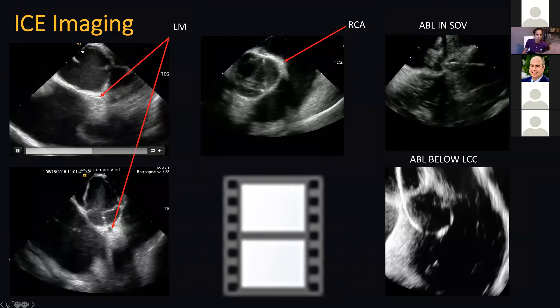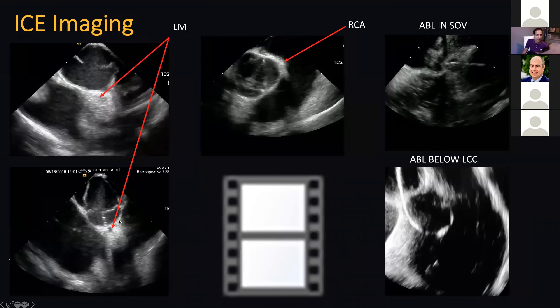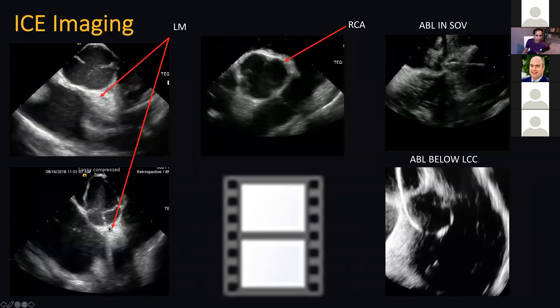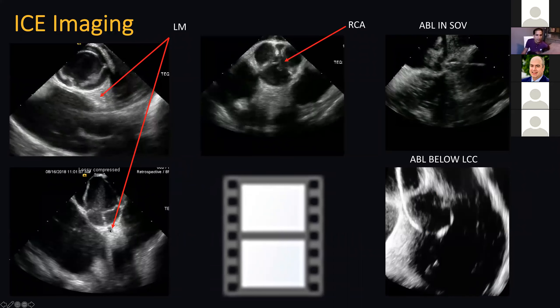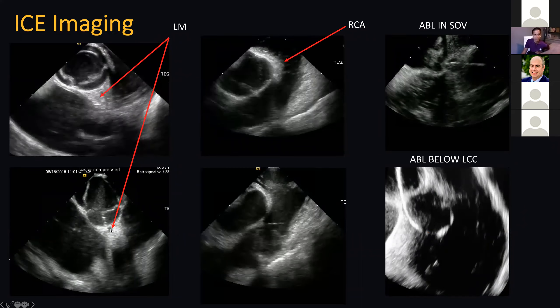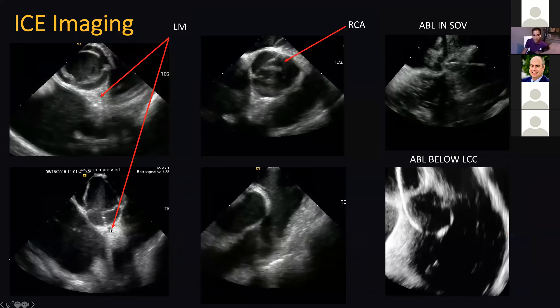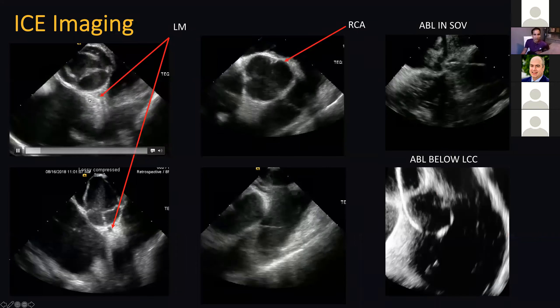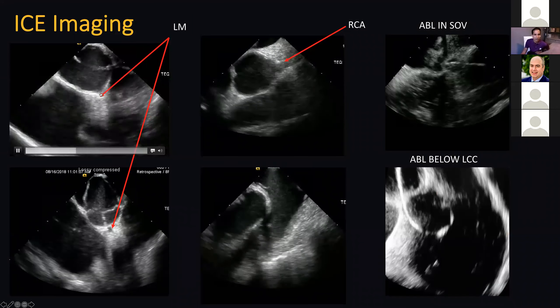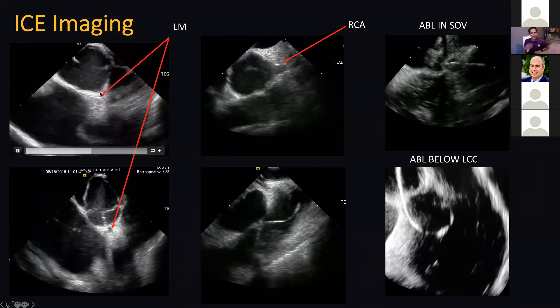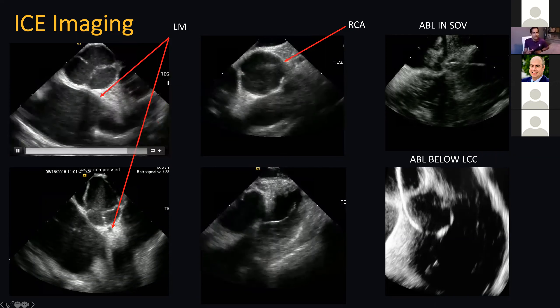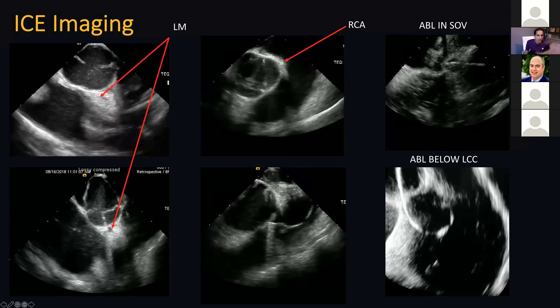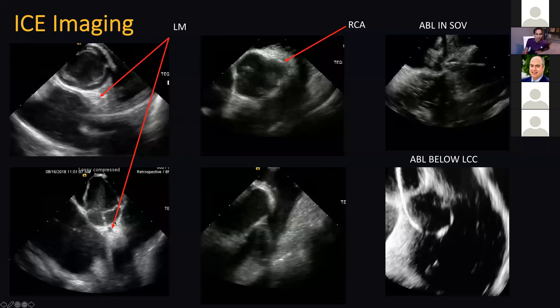Here in the bottom view, we have an ablation catheter inside the left main. I'm not recommending you do this all the time. Using Carto, you can actually map the left main coronary artery and tag it directly on your electroanatomical map. If you're using some of the other mapping systems, you don't have that luxury.